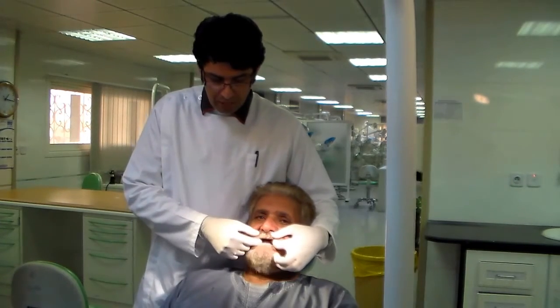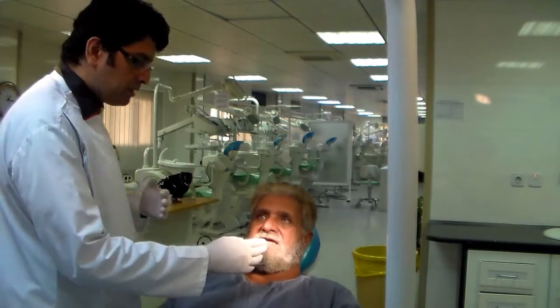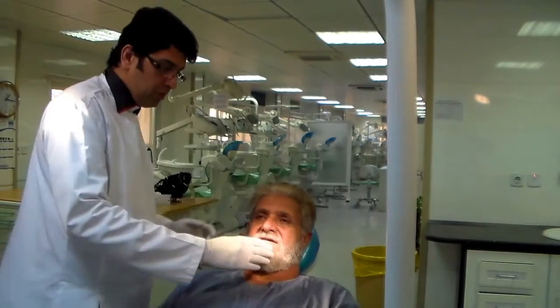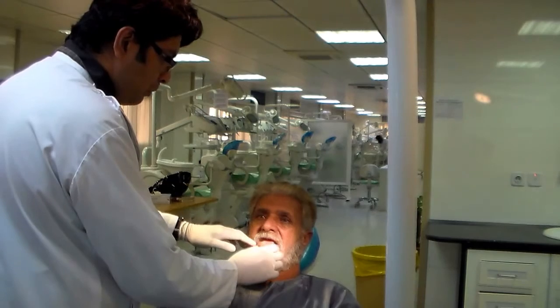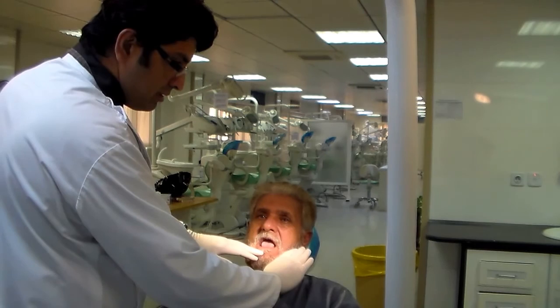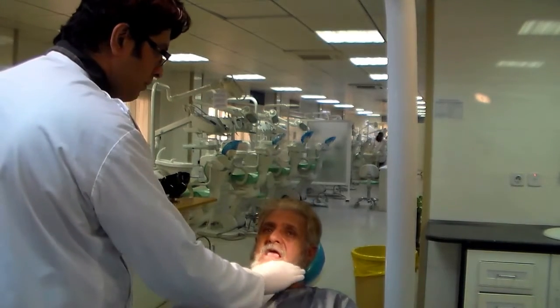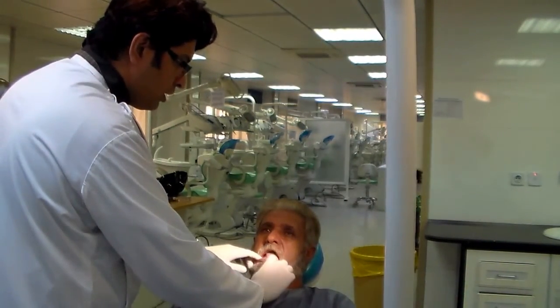When you come to the mandible, you're going to be standing in front of the patient, whereas for the maxilla, you're standing at about the 11 o'clock position behind the patient. In the mandible, if his head is upright when he opens, the mandible which was parallel is going to come down. So you want to recline the chair a little bit so that the mandible is parallel to the floor, and this is the position in which you will make your impression.